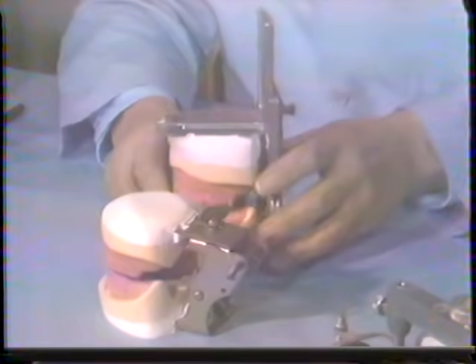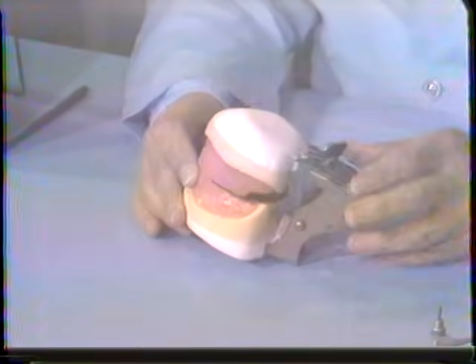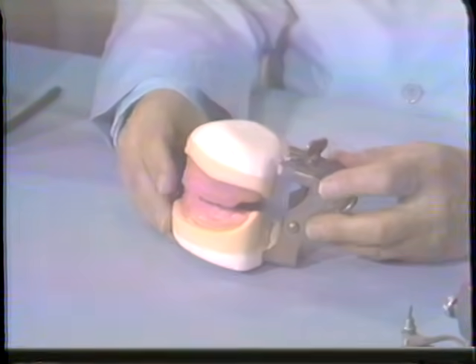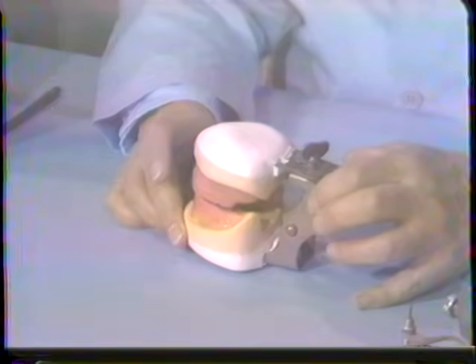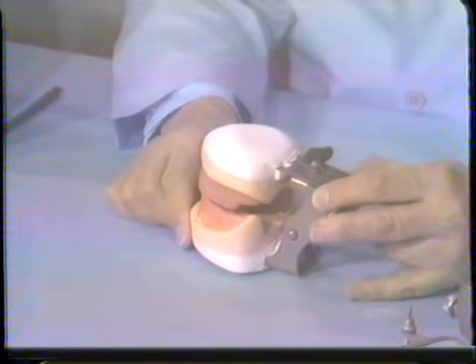Another simple holding instrument would be one that moves on a hinge. And that's all it can do. It holds the centric jaw relation record, and that's about all the transfers that we need to make. This particular one does not even have an orientation for a facebow transfer, as of course the previous one did not have it either.